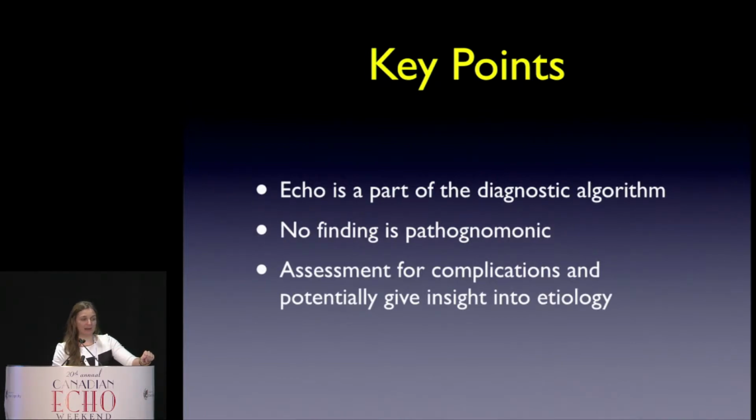So, key points: echo is part of the diagnostic algorithm. No finding is pathognomonic. It also helps in the assessment of complications and can give insight into etiology in rare cases.